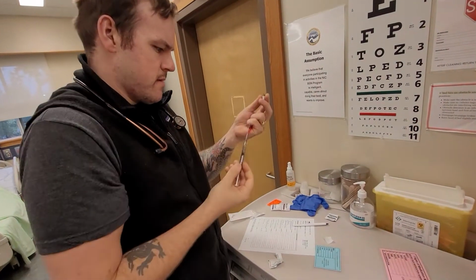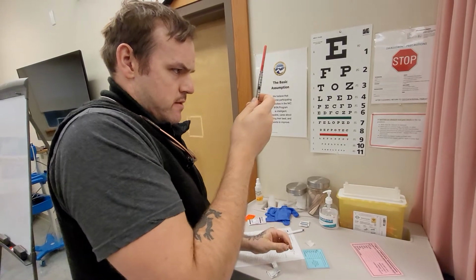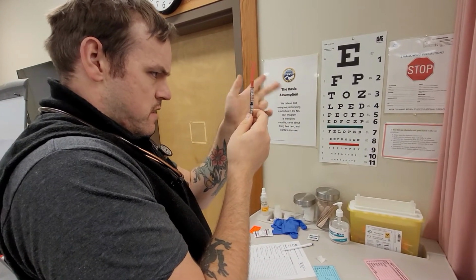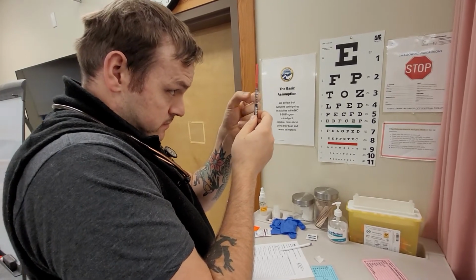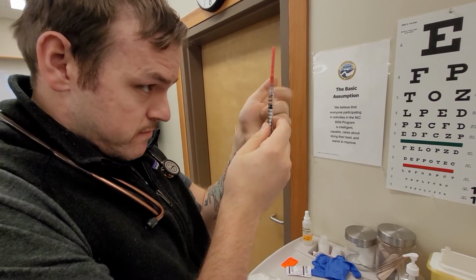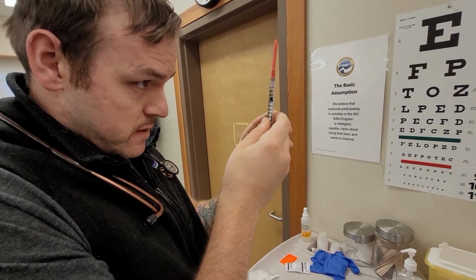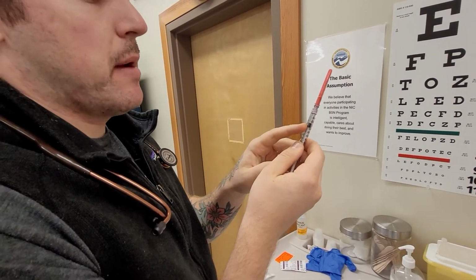0.25. So we get rid of these air bubbles. Perfect, and we've got 0.25 of the medication.